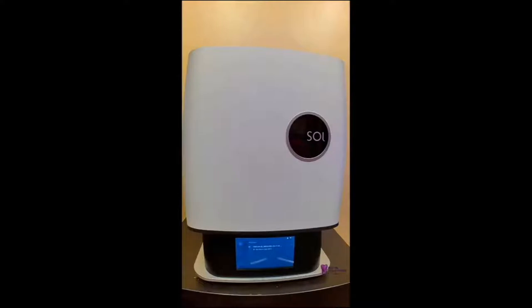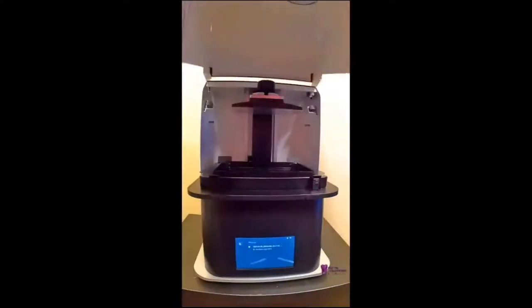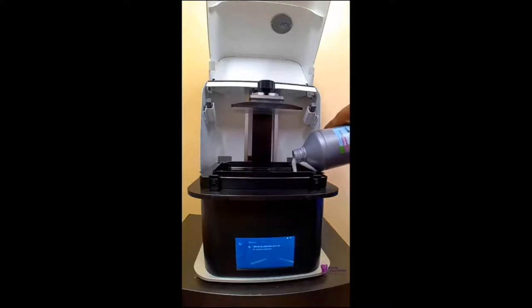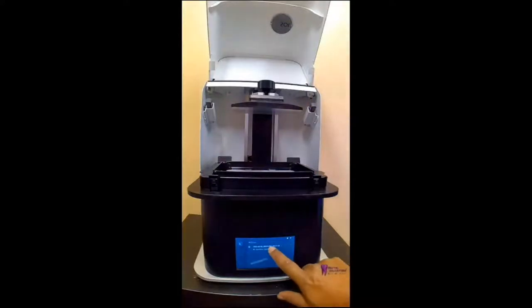So one of the nice things about the Accurata Sol is that it's pretty much a plug-and-play printer. To start the print, you make sure that the build platform is secure. Fill the resin tank with the resin that you want to print the model in. In this case, we're printing a temporary hybrid using NextDent MFH temporary resin. So we're going to fill that to the fill line. There's actually a measurement line in the tank itself, depending on how large the model you're printing. There are two different lines. And then we're just going to hit the file name on the touchscreen, which has been transferred over Wi-Fi from the Alpha 3D software to the printer.